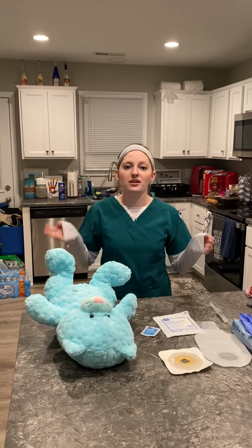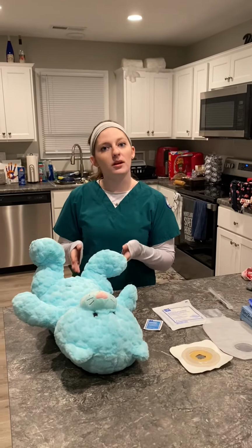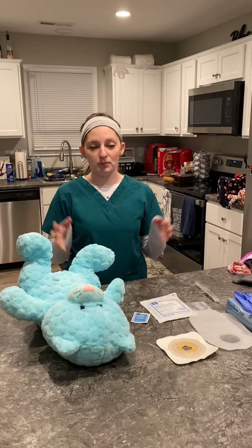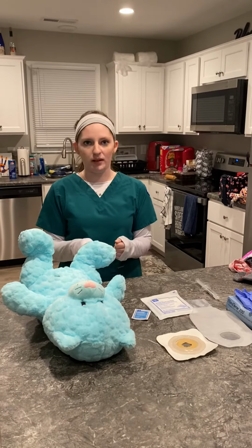So I'm going to start with COWIPE. I'm going to check my physician's orders and my allergies. I'm going to assemble my equipment and assess my patient. I will wash my hands. I will identify my patient and introduce myself. I will provide for privacy. I'll educate, explain, and evaluate.